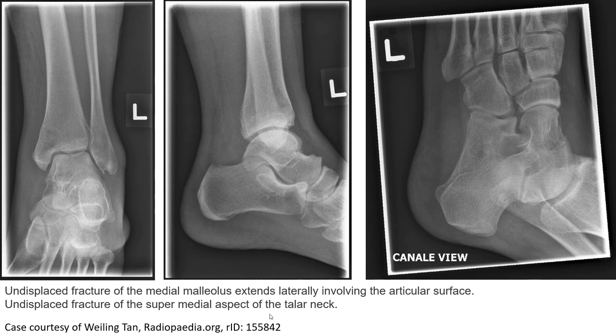Another example shows an undisplaced fracture of the medial malleolus extending laterally, involving the articular surface. There is also an undisplaced fracture of the superior medial aspect of the talus. The fracture line is appreciated on the Canale view and clearly seen on the frontal view, but is hard to identify on the lateral view.